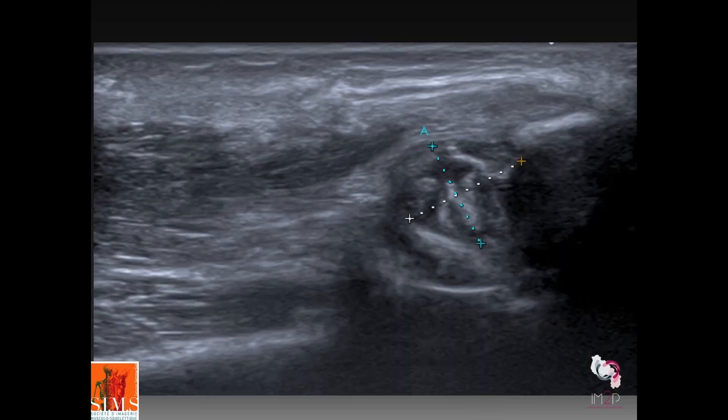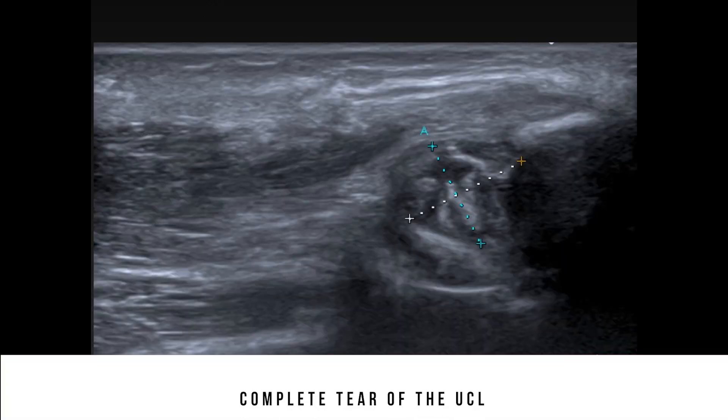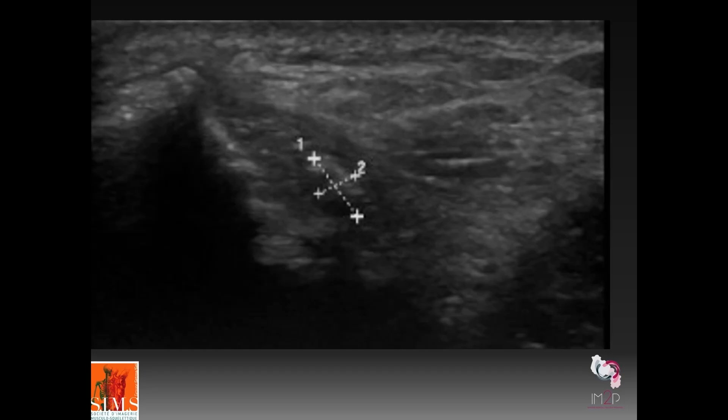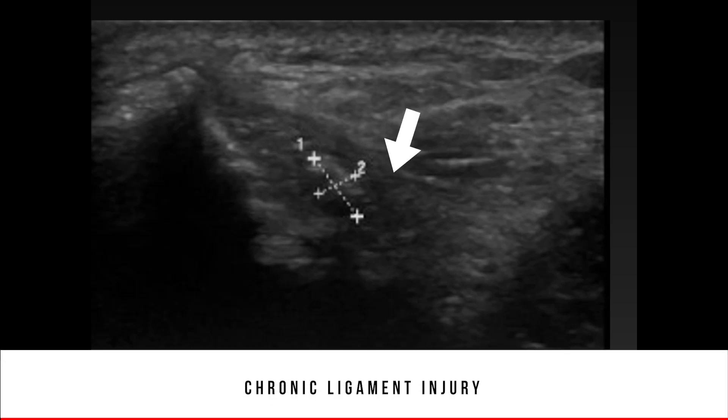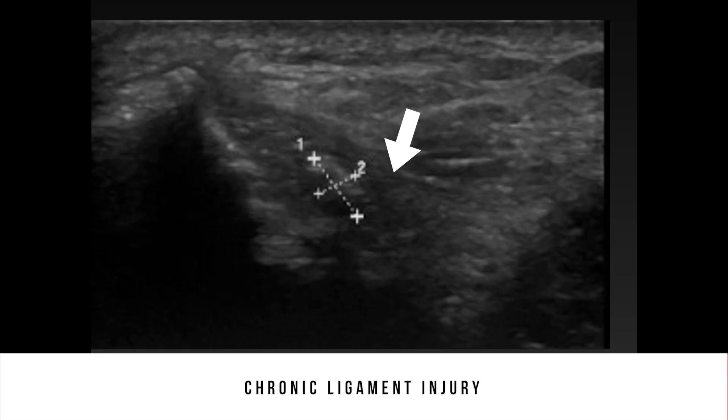Here, you can see a complete tear of the ulnar collateral ligament with this proximal ligament stump, evidence of a grade three tear. In this final example, we can see evidence of chronic ligament injury: a small hyperechoic area within the ligament, evidence of an old tear that is now in the chronic stage.